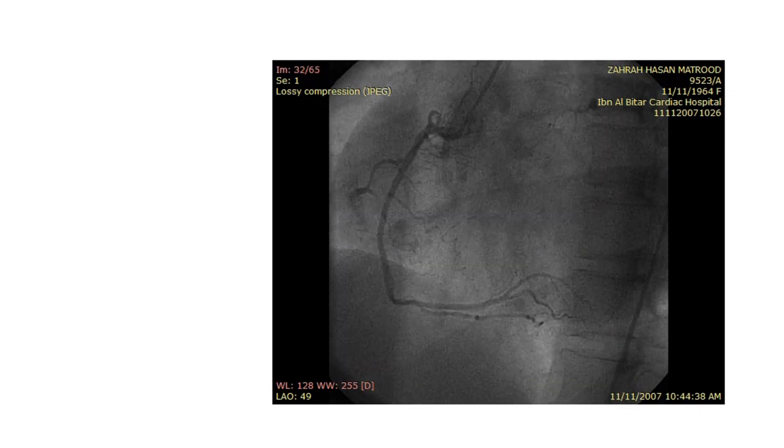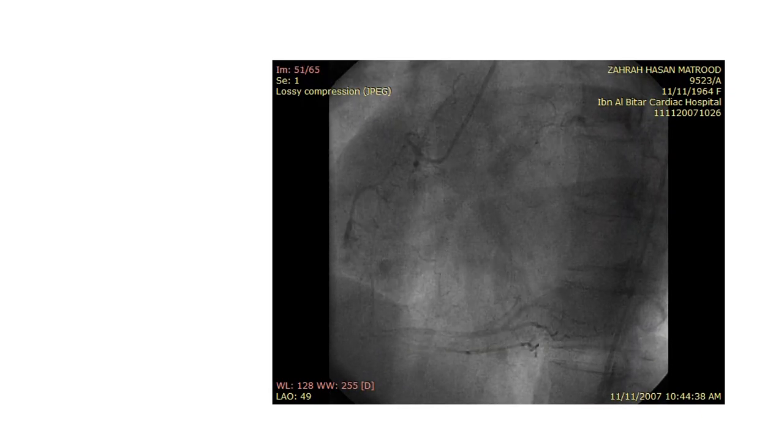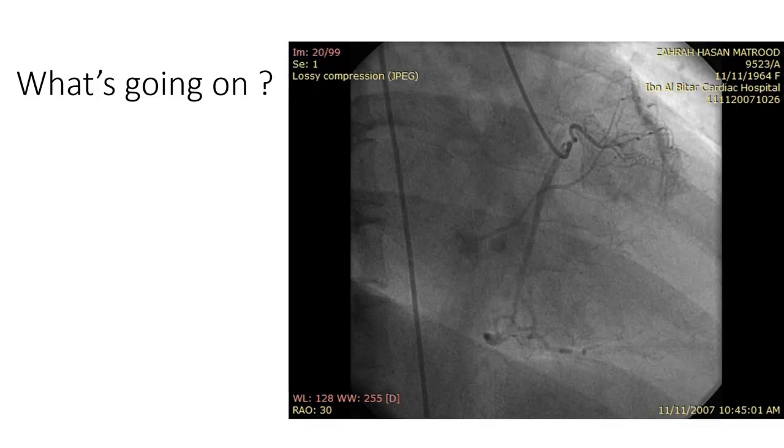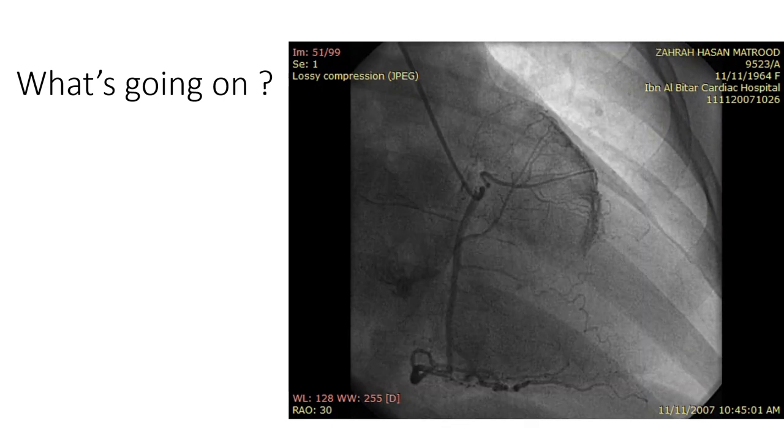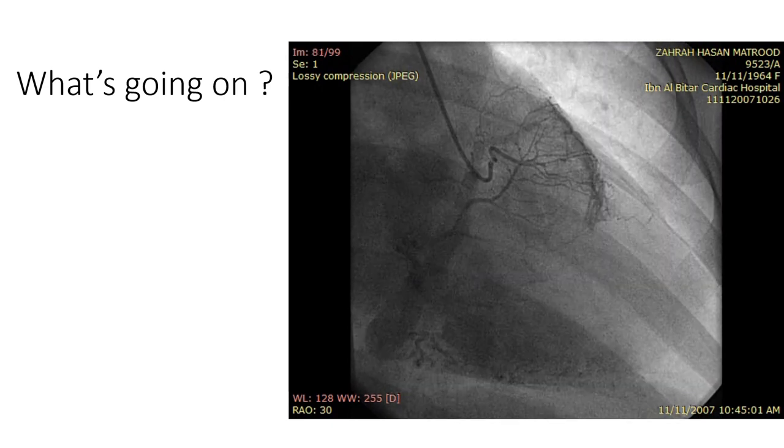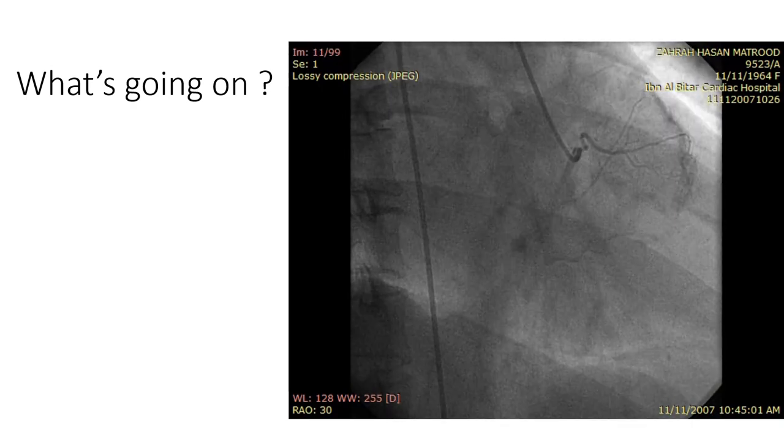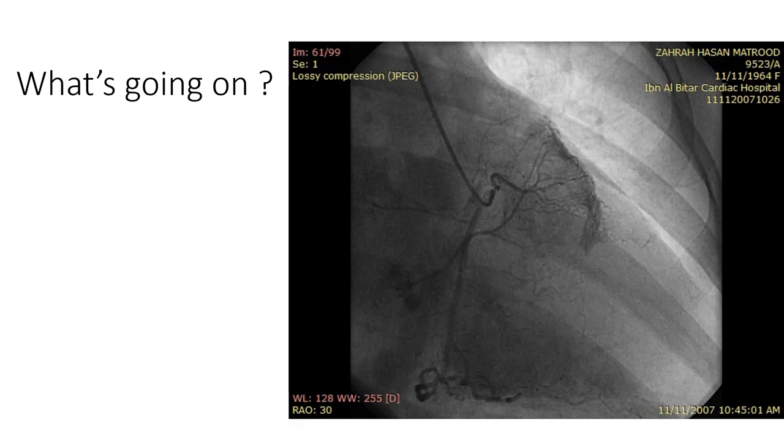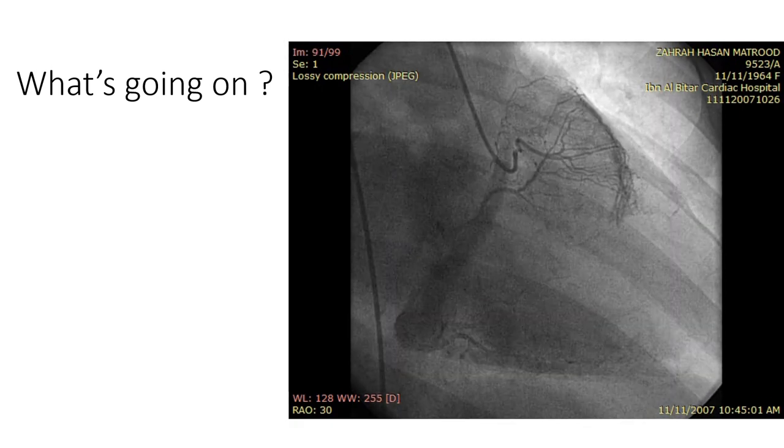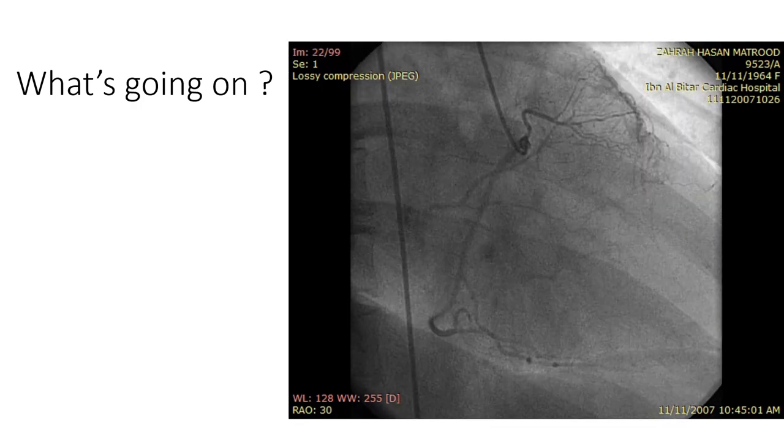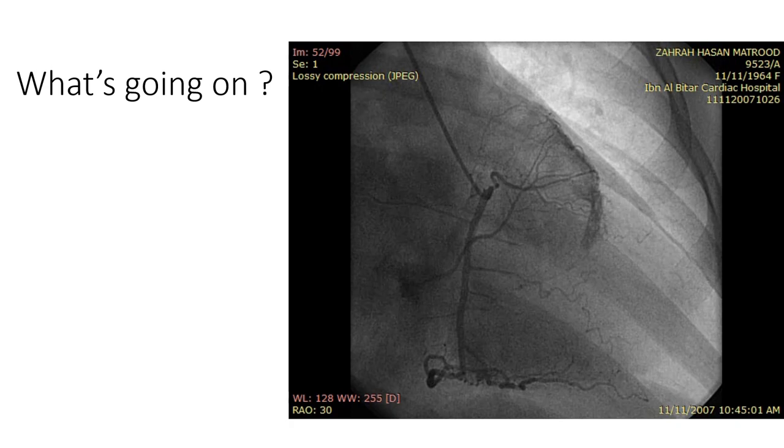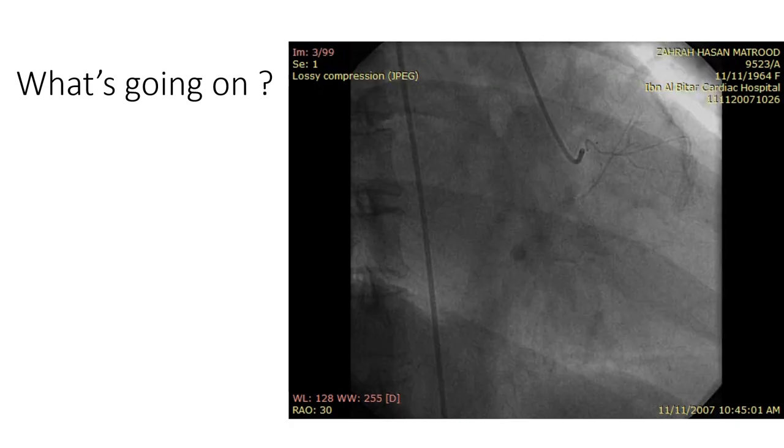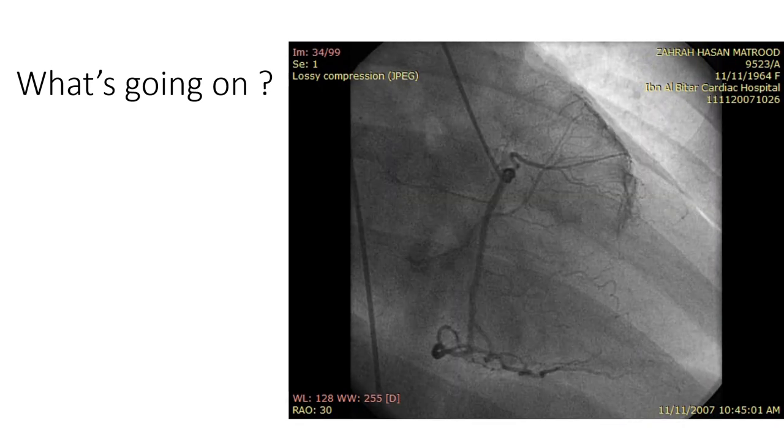Oftentimes, the RCA is deeply engaged and the catheter passes into the conal branch. The conal branch supplies a sensitive RVOT. We see in the view the catheter has occluded the conal branch. We can see myocardial blush and dye remaining in the arteries and capillaries without being flushed by the bloodstream. This caused ischemia and ended up with VF. And this concludes our remarks for the angiography. Thank you.